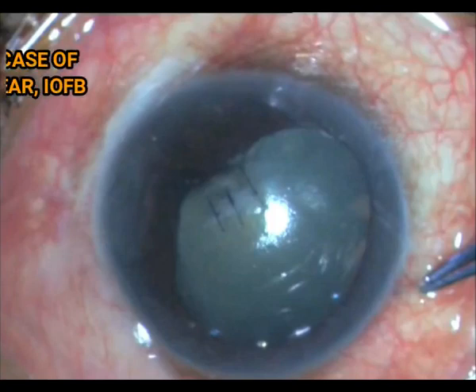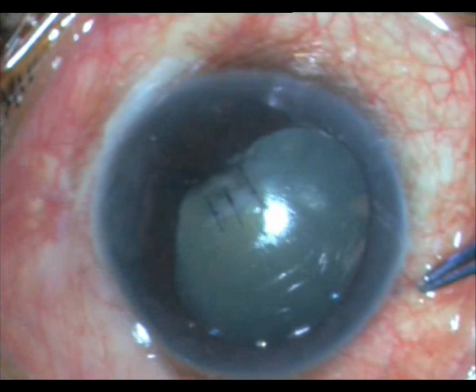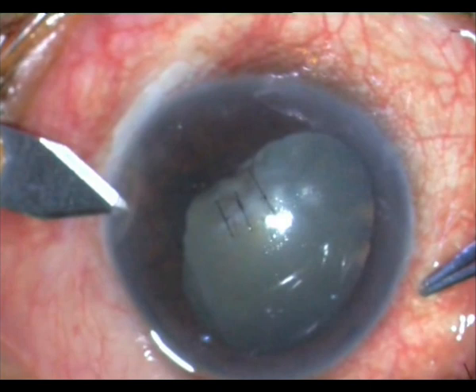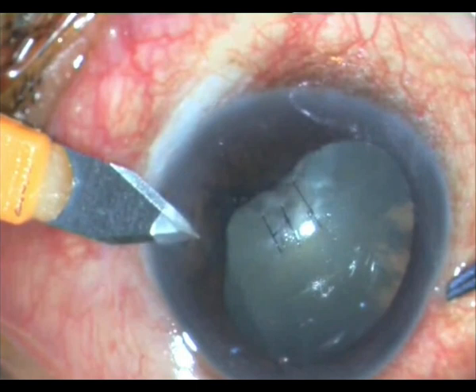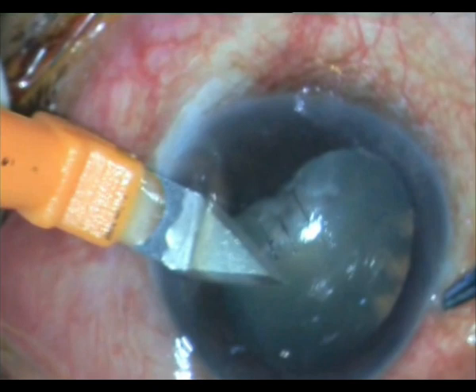This is the same case who had presented with a penetrating injury and retained intraocular foreign body. I had removed the foreign body and also repaired the corneal tear, but I did not handle the traumatic cataract — though present at that time, I didn't handle it at the same setting. Instead, I opted to wait almost three weeks, because if there is no emergency to take out the cataract, I just leave it. I wait for the capsular tear edges to fibrose, making it much easier to handle the cataract later.